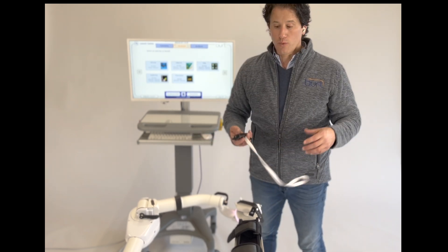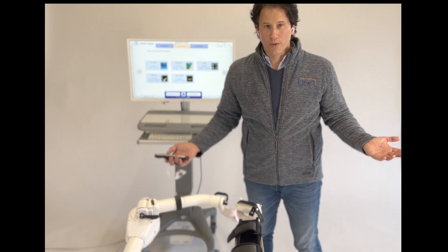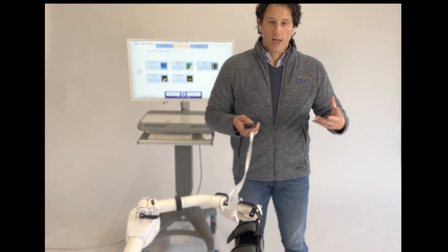Burt Resist is where the Burt is resisting the patient. What's the purpose of movement and range of motion if you don't have strength? So we wanted to create a way to help build strength.